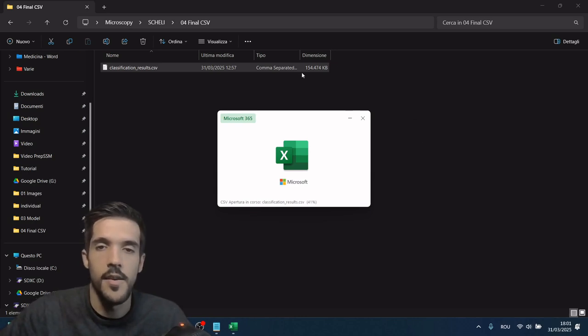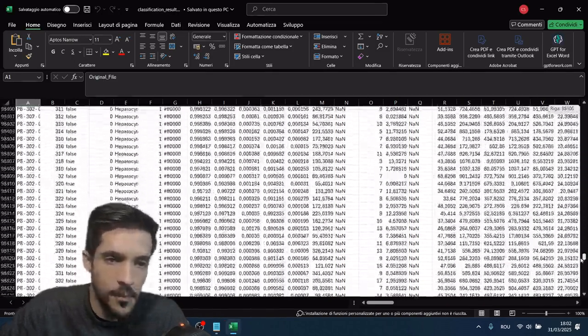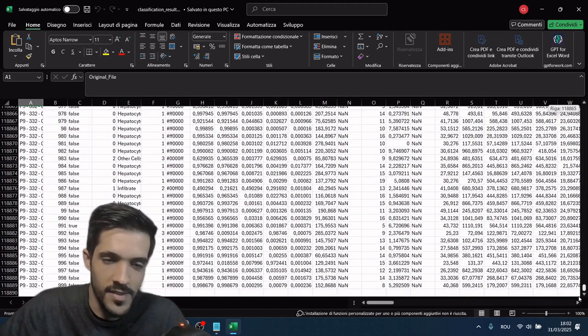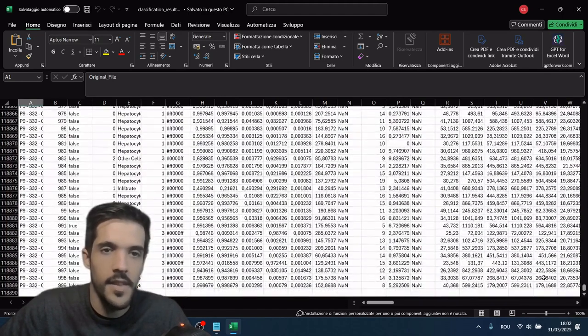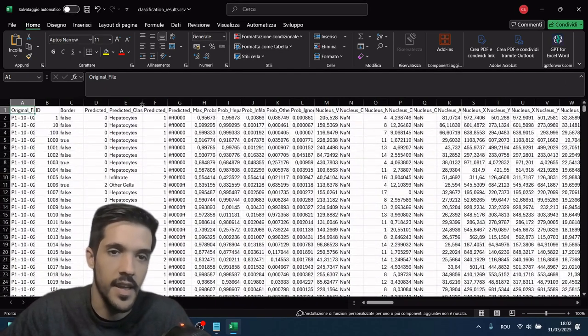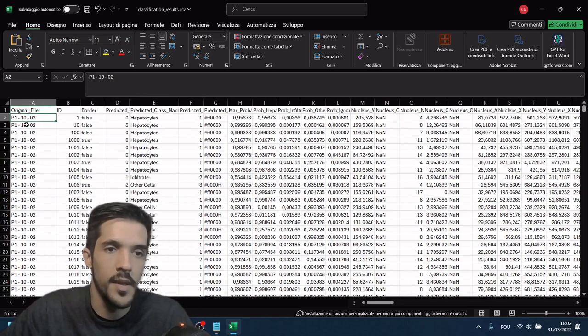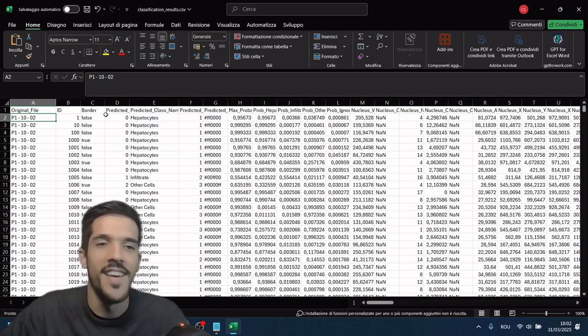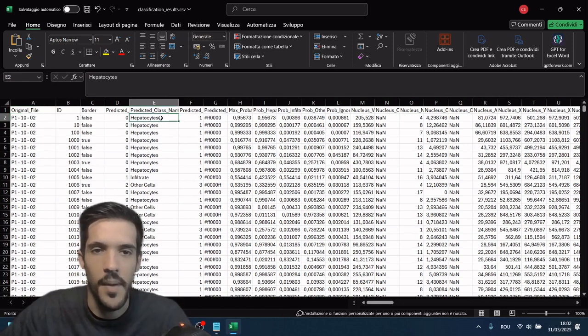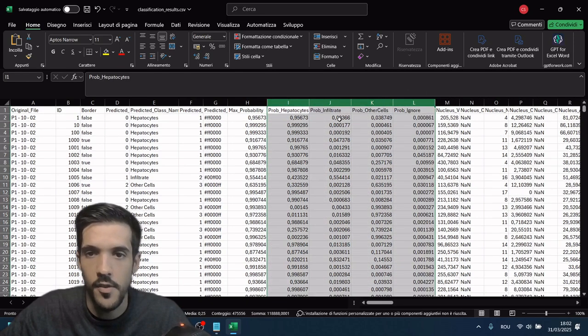It joins together all of the files from the individual CSV folder. So the final result, it's pretty big if you have a lot of cells. Yeah, and here you can see we have the class. This is a previous analysis I had done, and we have, for example, from the file P1, cell 1 is hepatocytes. This is the accuracy that it is a hepatocyte, and here are the probabilities for each class.